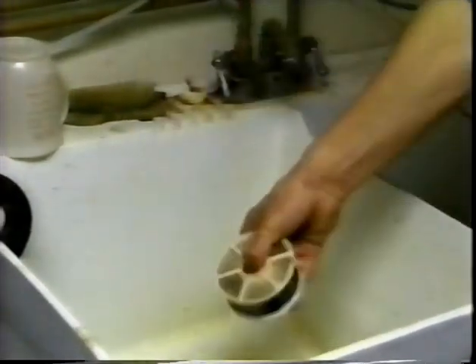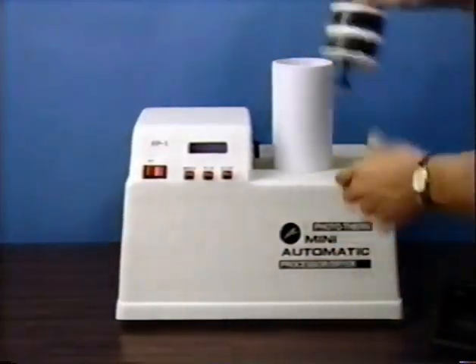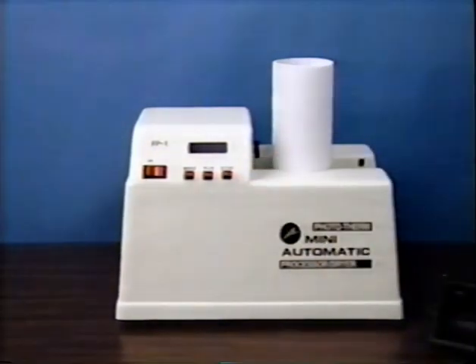When the chemical cycles have finished, the unit alerts the operator to begin the drying cycle. The drying tube is placed in position, and after shaking the excess moisture from the film reels, the rod and reels are placed into the drying tube. Push the start button to begin the drying cycle, which takes approximately 15 minutes. If distilled water is used to mix up the final stabilizing chemical, it is possible to dry the film on the reels without spotting or streaking.